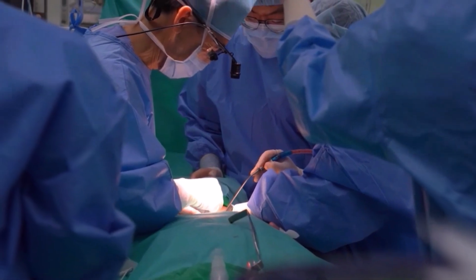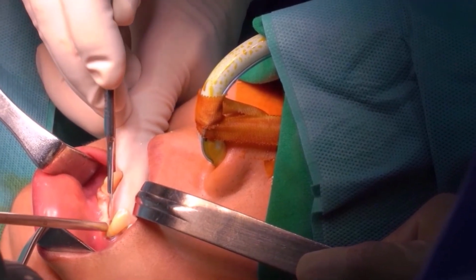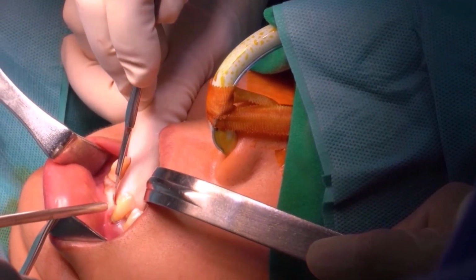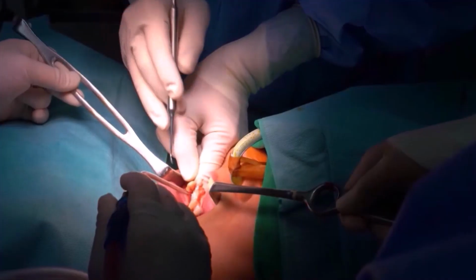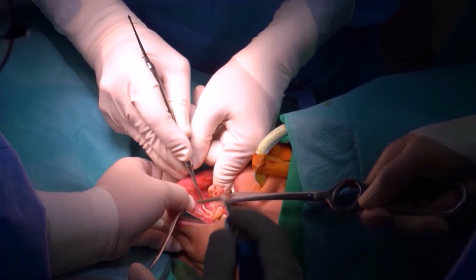We performed the surgery under general anesthesia because the patient was afraid of the operation. Another reason was severe bleeding could occur during bone reduction. It's easier to control the bleeding under general anesthesia.